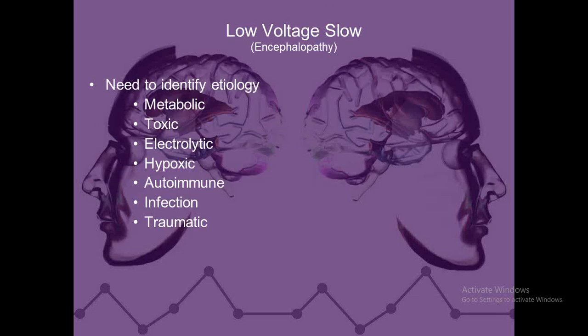So I found the most common that I've run across in my 15 years of doing this is metabolic issues. We've actually identified there's a certain bursty pattern to the EEG that the doc can call, and it comes back that it's associated with Hashimoto's thyroiditis.